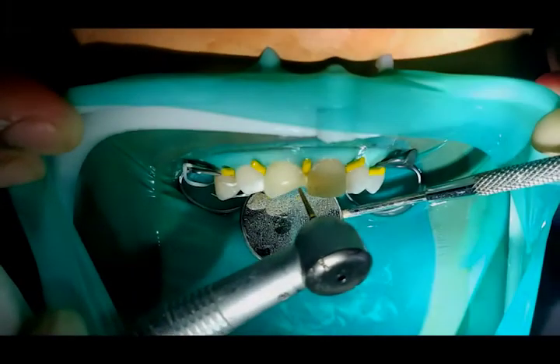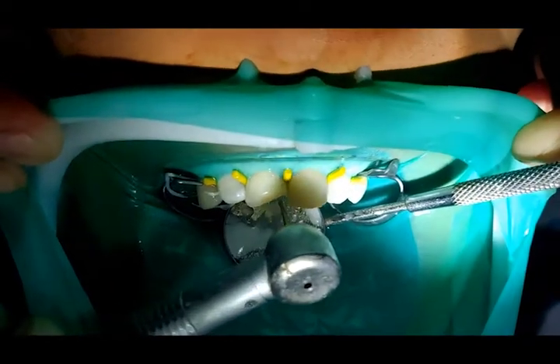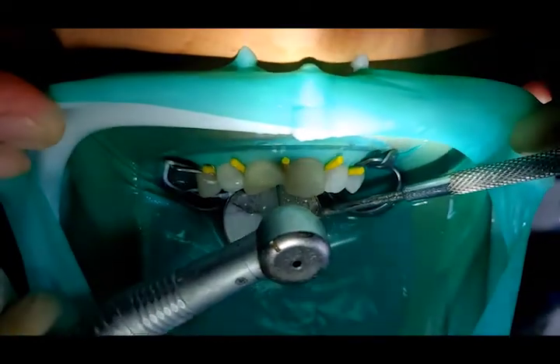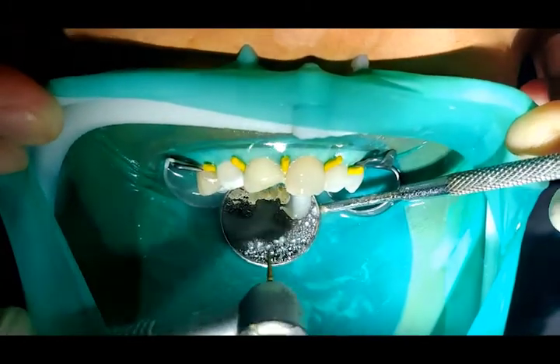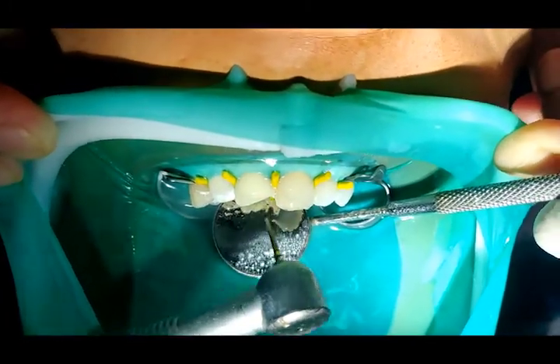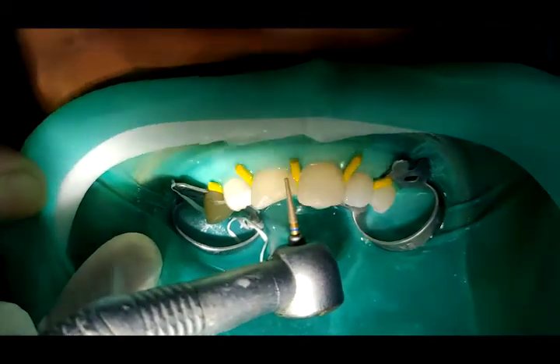After shade selection, we will be moving on to tooth preparation. A difficulty faced here is that we often give too little bevel on the enamel, thereby compromising the retention of the restoration. So in this case, a functional bevel of 45 degrees, 0.5 mm, is given on the lingual surface. This bevel is too sharp for the facial aspect and creates a visible junction at the composite-tooth interface; hence, it is not recommended on the facial aspect.